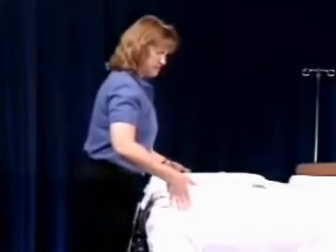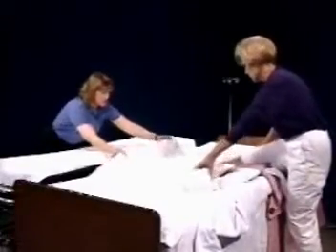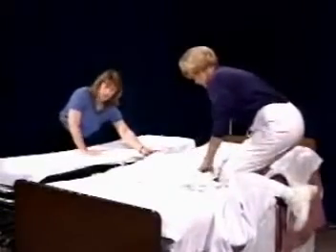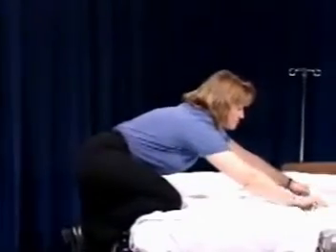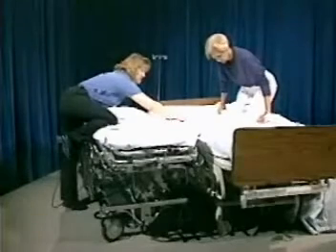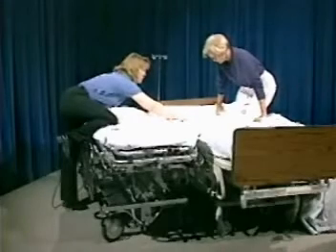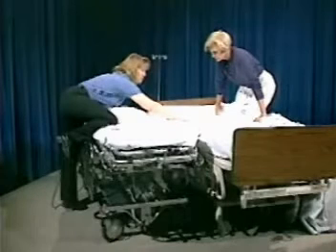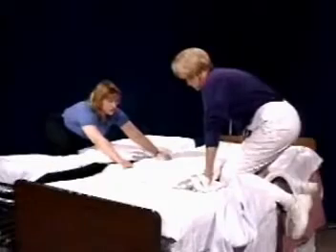I'll play the position of the middle caregiver on this side. We would take the draw sheet and make sure we have a good overhand hold on it. Now, if you're short like I am, you probably will need to get one knee up on the bed as well so that you're not straining your back. Make sure that you explain to the patient what you're doing and reassure them as you're transferring them. And you would have one caregiver giving the count of 3. And on the count of 3, we would move the patient in one smooth coordinated movement. 1, 2, 3.